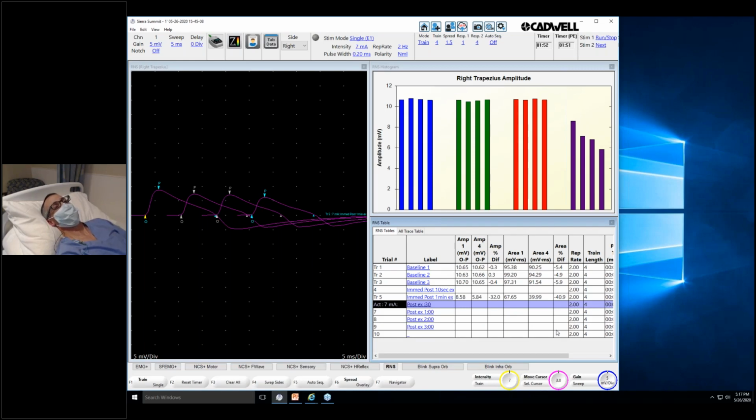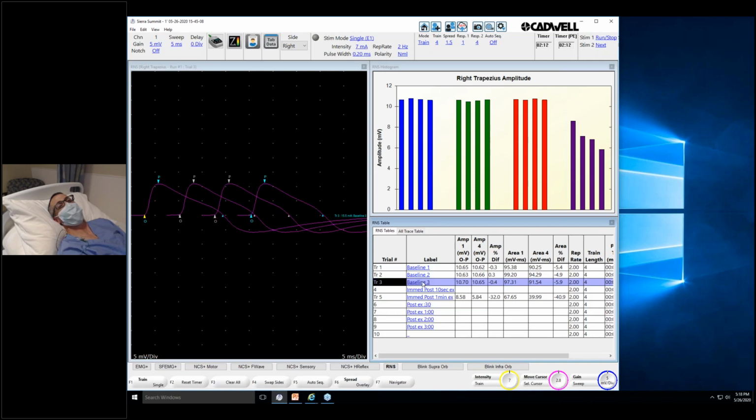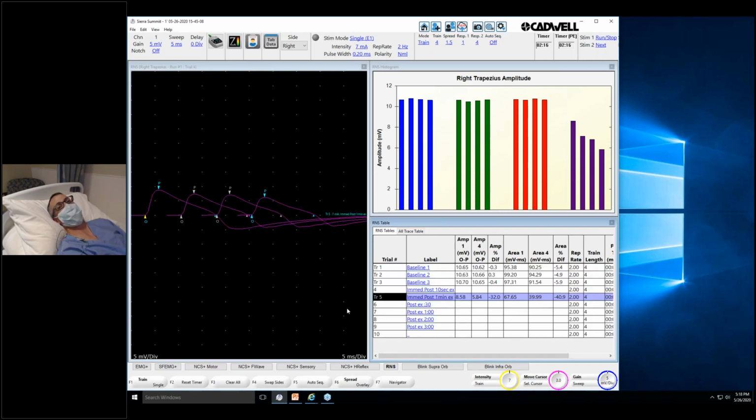Yeah, those are really good questions. Personally, I don't find it all that helpful to see repair of decrement. For those of you not as familiar, if you exercise for 10 seconds, that mobilizes more acetylcholine, and that will lead to some improvement of the decrement, called repair of decrement. So if the decrement's at 12% at rest at baseline, you exercise for 10 seconds, in someone with myasthenia gravis, the decrement might go up to 5%. It might improve temporarily.